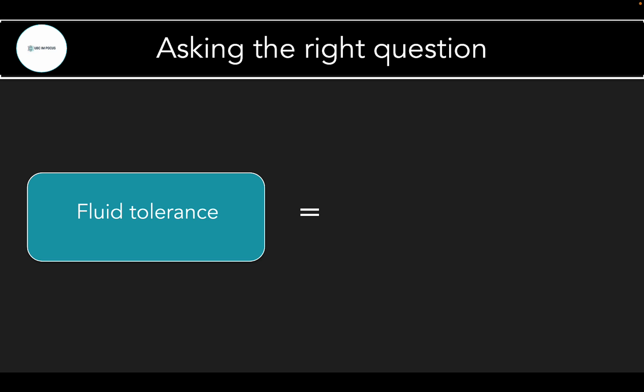On the other hand, the IVC can be much more useful for fluid tolerance, so that is, assessing for the potential harms of additional fluid administration. And remember that the job of the right heart is to keep filling pressures low, so elevated filling pressures, a high CVP or a plethoric IVC, are an indication of some pathology. And the first and necessary step to right-sided organ congestion is an elevated CVP, so the IVC can often serve as a useful warning sign here.